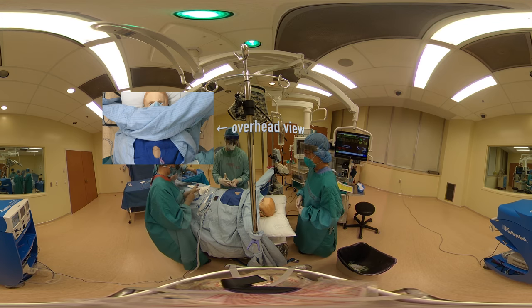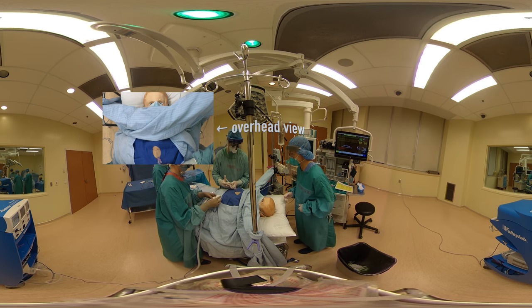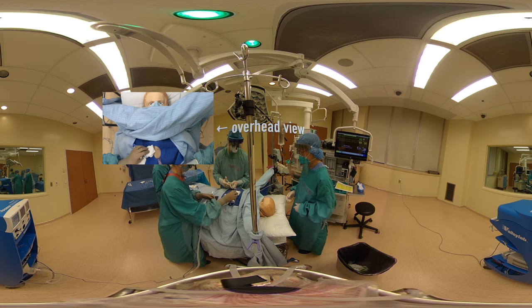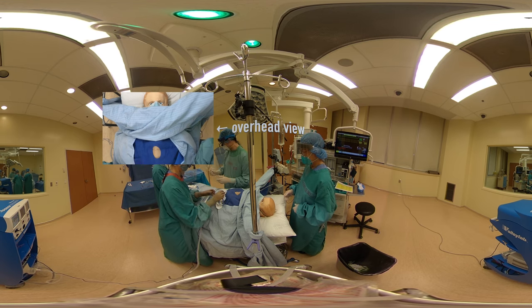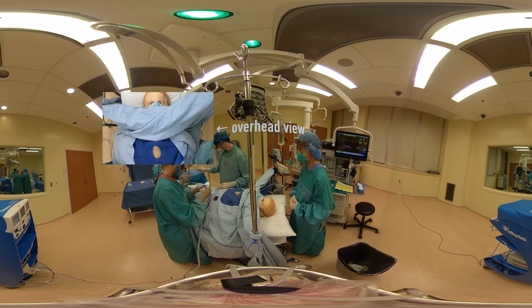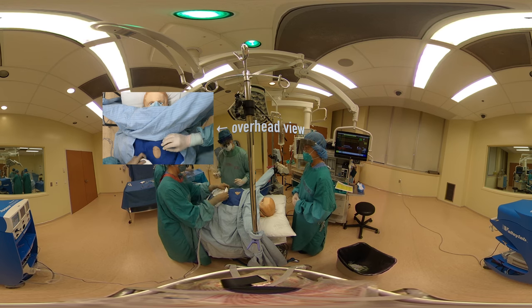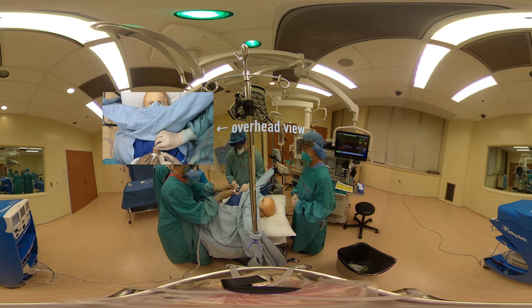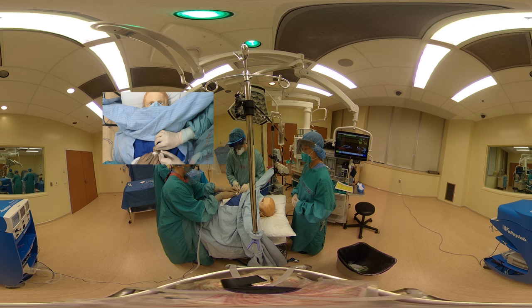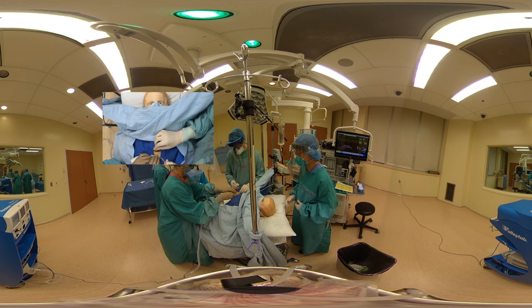We'll infiltrate some lidocaine into the soft tissue of the neck here for analgesia and hemostasis. Okay, you're doing great. Take the 15 blade. We're going to get started here. We'll do this quickly. A little bit of pressure here. Good incision.